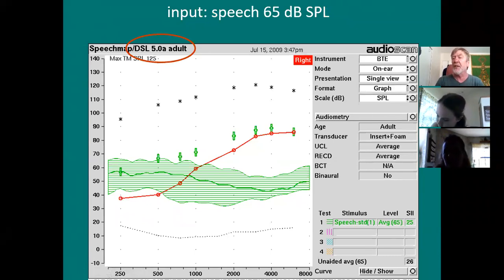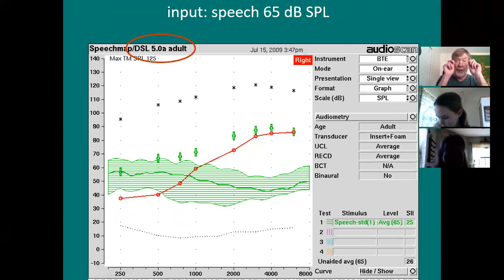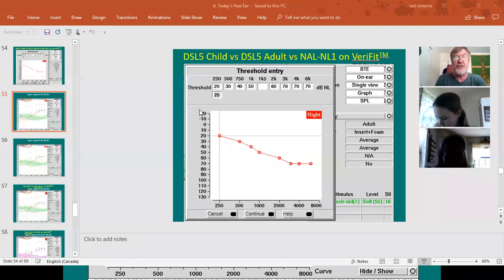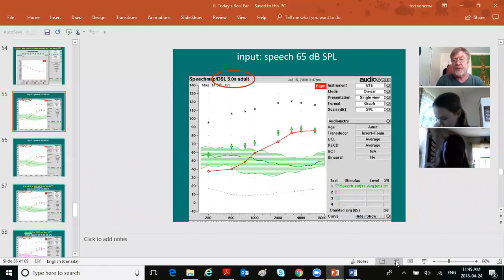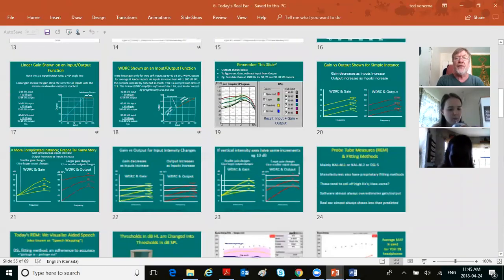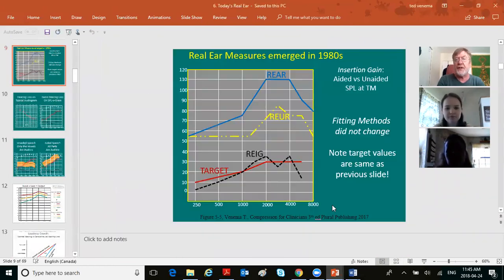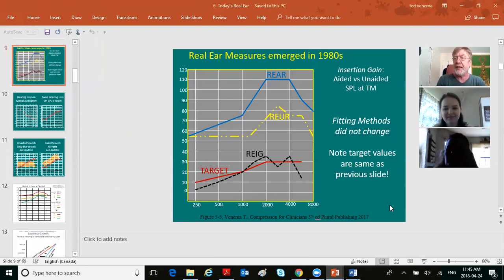When you're looking at old real ear with REAR and REUR on the bottom, and then you'll see a target and a real ear insertion gain, that does not explain what's happening in terms of speech. It's very hard for a person to understand what's happening in terms of hearing speech. And honestly, looking at this doesn't tell you anything.